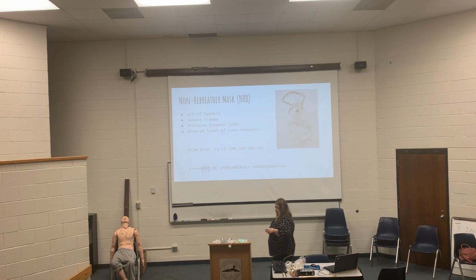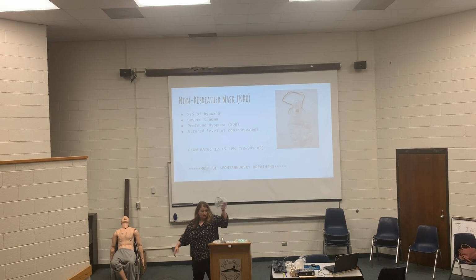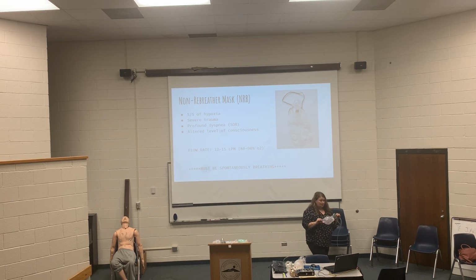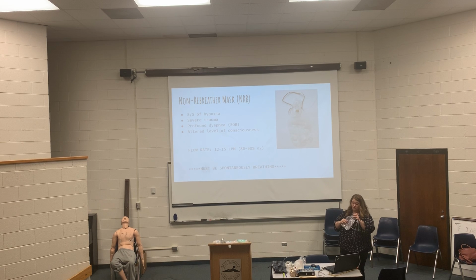So, non-rebreather, that's this. The flow rate for this is 12 to 15. Some people do go with 10, but you really want to make sure that this bag stays blown up the entire time. And I did a little bit more studying about these things so I could really tell you guys the true way instead of my interpretation of what they do.